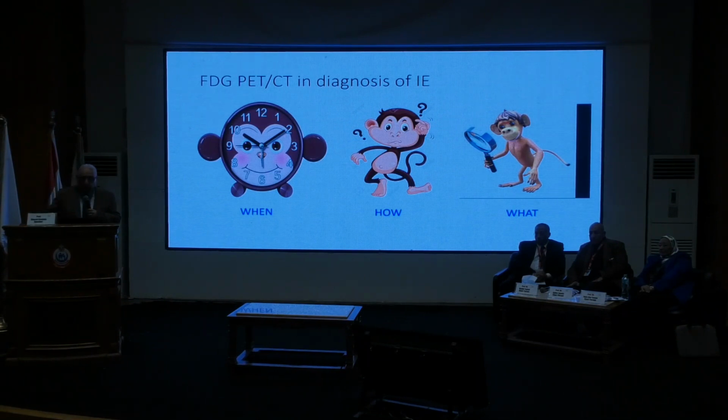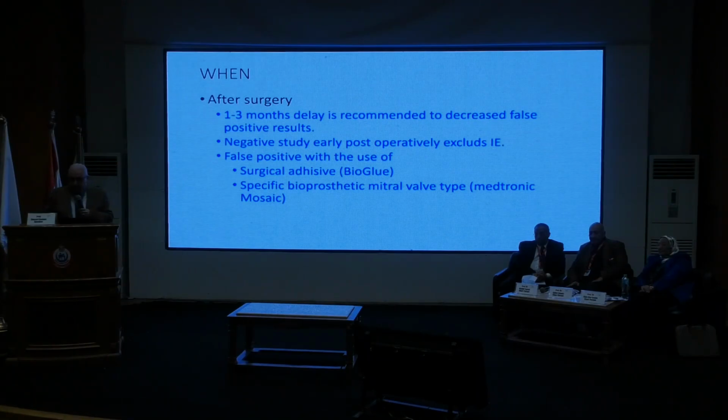Now we need to know when to do the study, how to do the study, and what to look for. When to do the study? After surgery. The European Association of Nuclear Medicine has suggested that we wait 3 months after surgery to reduce the incidence of false positive results. Other studies have said that we can do it after 1 month. So between 1 to 3 months is a suitable period after surgery.